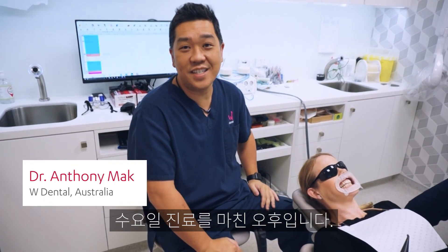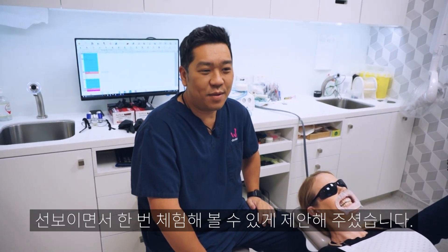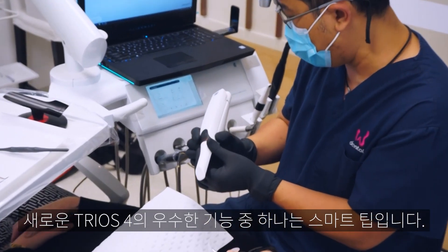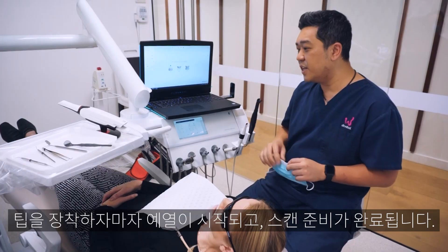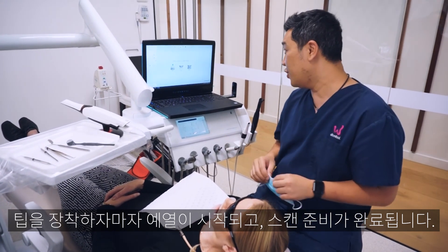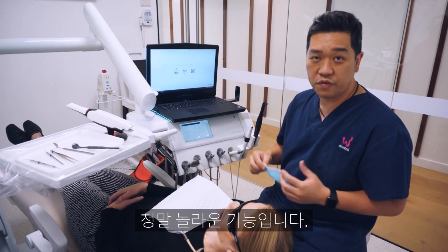We're here after work on a Wednesday — dentistry never stops. Three Shape decided to pop in and bring in the new Trios 4 for me to try. One of the cool features of the new Trios 4 is the tip: basically as soon as you put the tip in, it's really warm and it's ready to go. I haven't even put my gloves on and it's ready for me to scan.